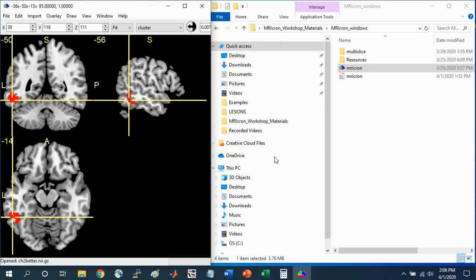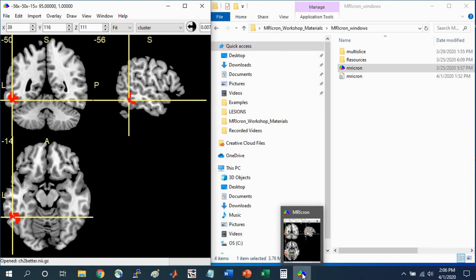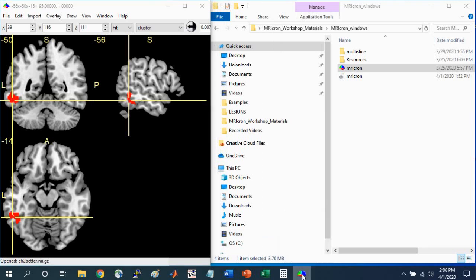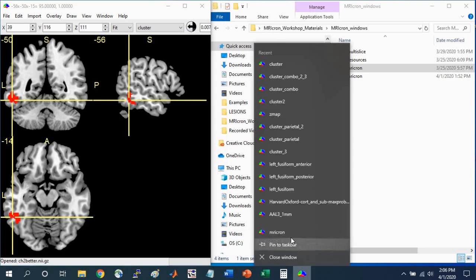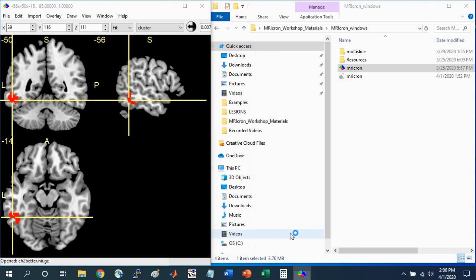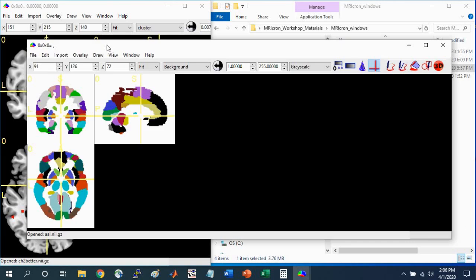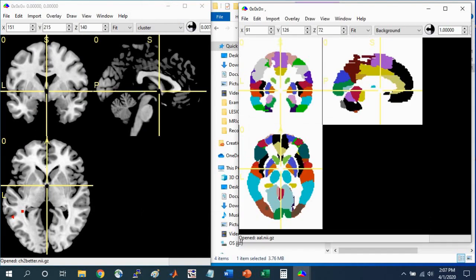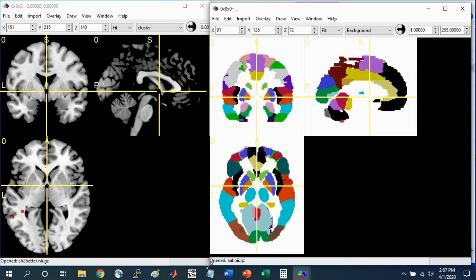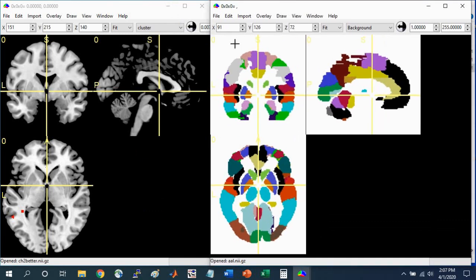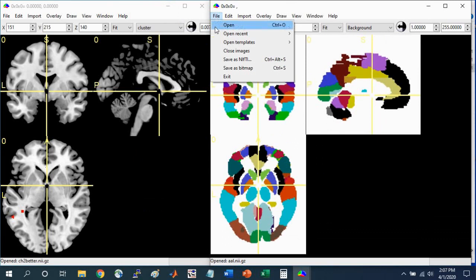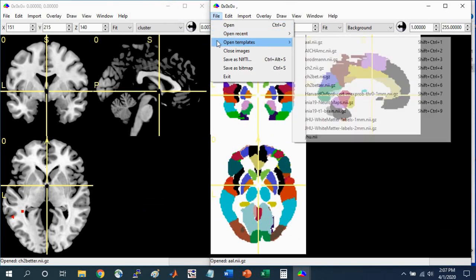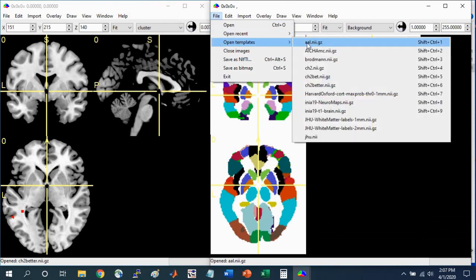you can use a standard brain atlas to identify what brain regions are associated with this cluster. What I'm going to do is open another MRI-Cron window. I'm going to right click down here at the bottom and select MRI-Cron. This actually opens to a default anatomical atlas that comes with MRI-Cron. For you to open this, go to File, Open Templates, and this is the AAL Atlas, the Automatic Anatomical Labeling Atlas that comes with MRI-Cron.